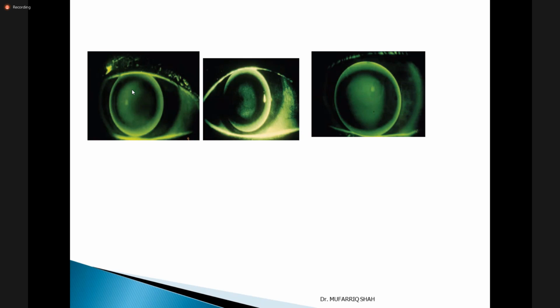In PG, the dia is greater. And in Rose K2 KC, the dia is between the IC and the NC in most cases. Not in 100%, in most cases, because in some cases there will be a nipple cone, but you may need a large dia. And in the other case, it may not be a nipple cone, but you may need a small dia. But in most cases, you will observe like this.